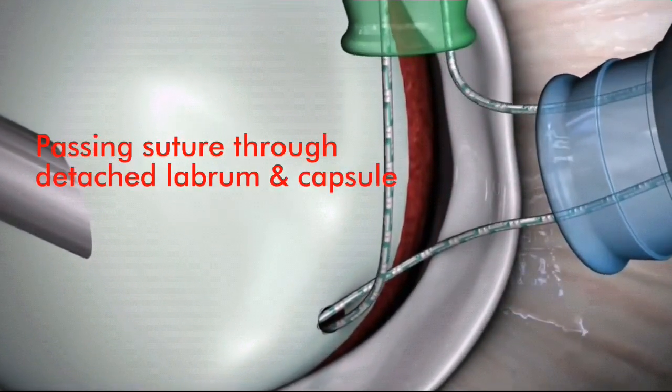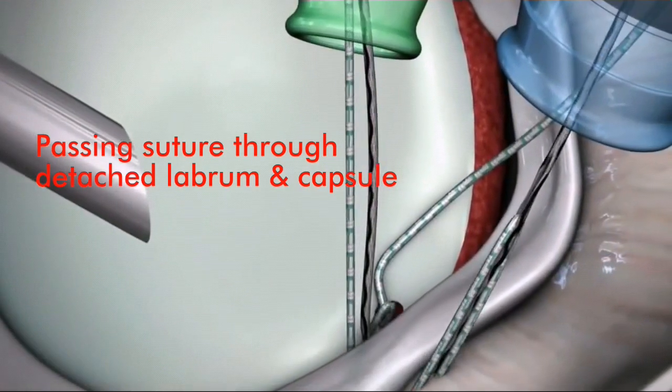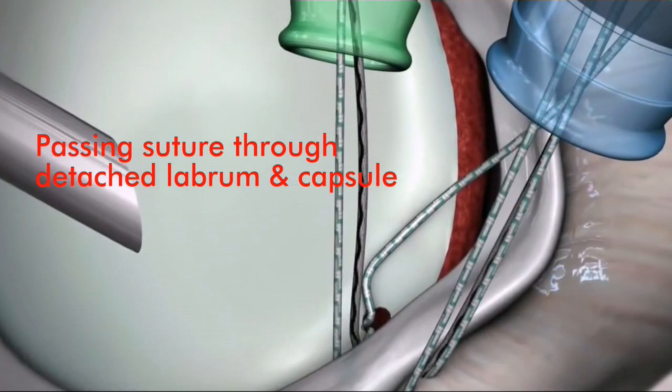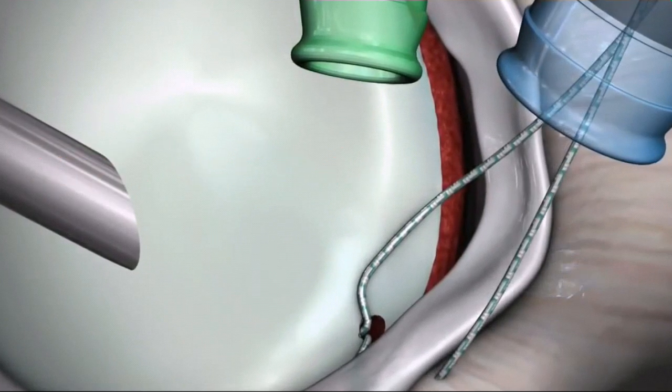Retrieve a suture limb through the anterior superior portal and use the appropriate spectrum suture hook to shuttle the appropriate limb of suture through the capsule and under the anterior inferior labrum.